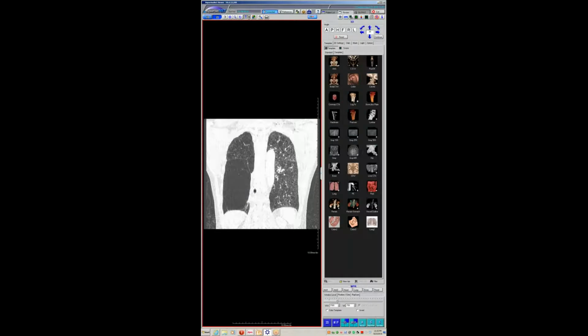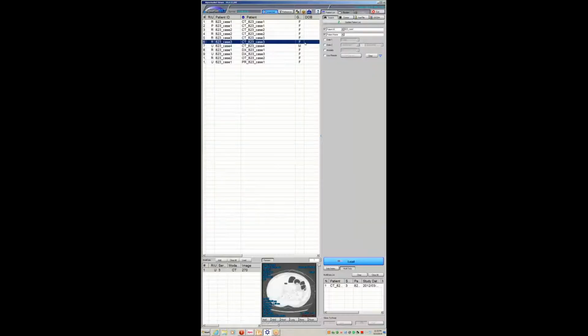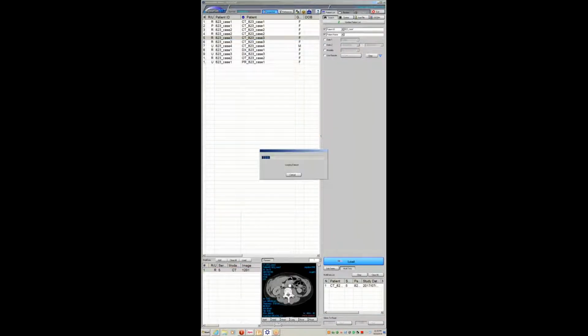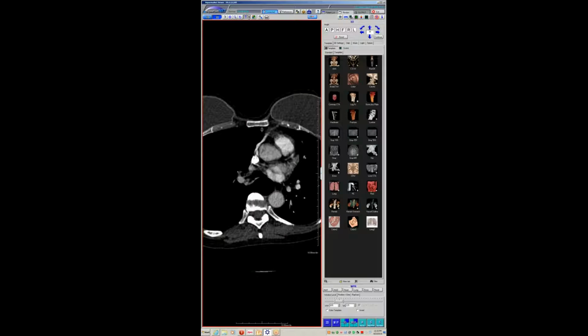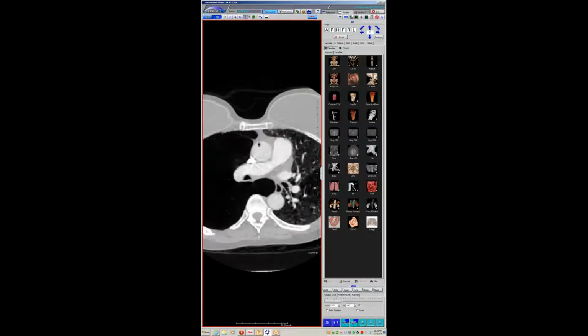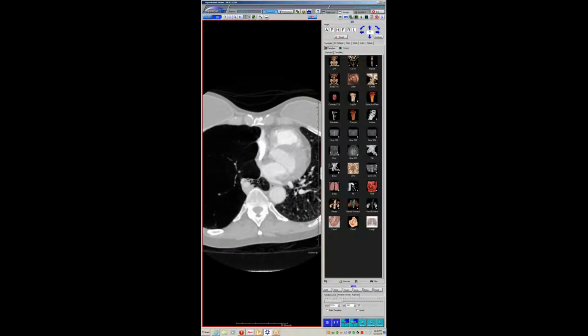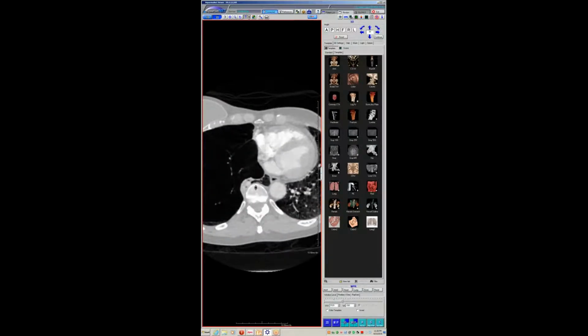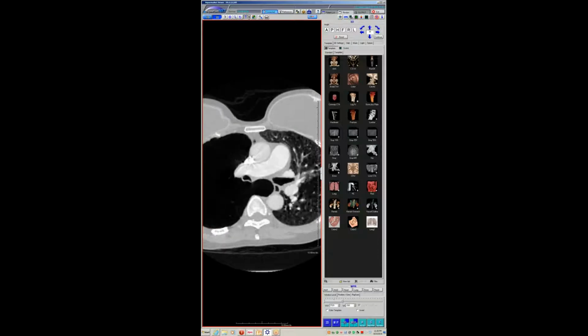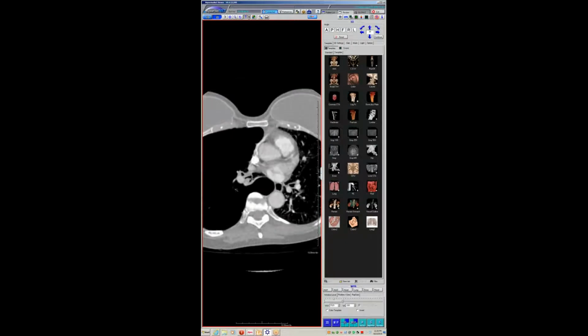I just don't know. So Seth, how big are the vessels going to these lungs? Can we look at a soft tissue window and see if there's a full size of pulmonary arteries and things? Sure. Yeah. So this is the most recent case. And so the vessels to the right middle lobe are attenuated, to say the least. I mean, here's medial segment, here's lateral segment, and these big guys are just basically going into that completely consolidated, collapsed right lower lobe, and then these bigger guys are going into the right upper lobe. So it really is dramatic vascular attenuation into that.